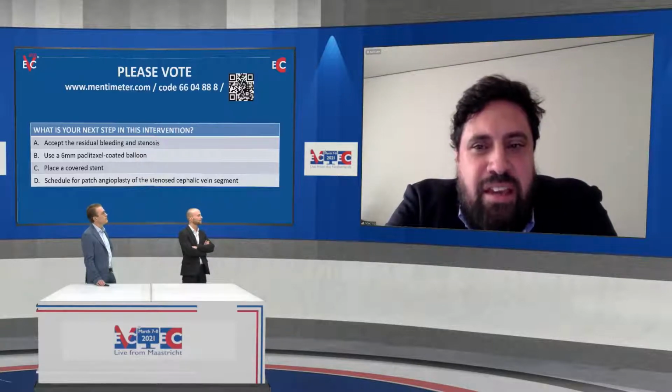You do a lot of endovascular work, but you also do surgery. When would you actually do a patch angioplasty for these kind of stenoses? I think in this beautiful case, we have completely the recoil of the stenosis. So the wall damage and the recoil of stenosis, I think probably the stent graft in this case is a better solution. Is there any way you would go to schedule a patient for surgery with a simple outflow stenosis that causes flow dysfunction, or would you always go endovascular?